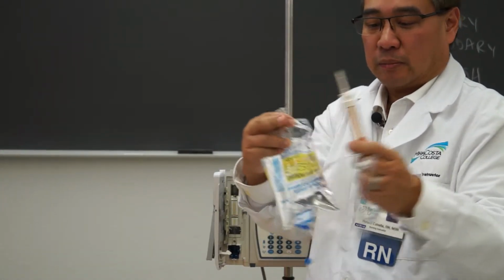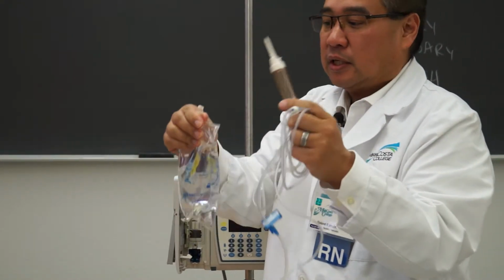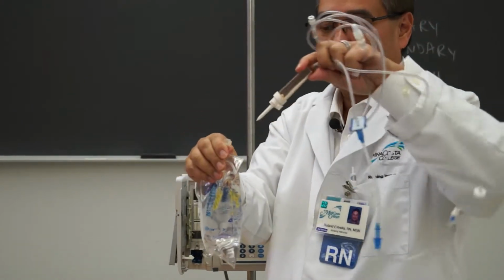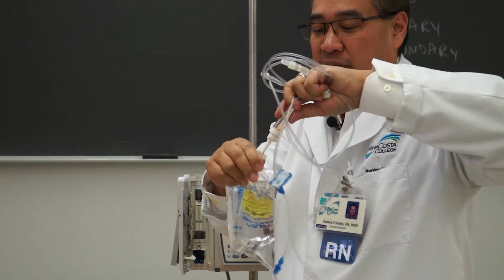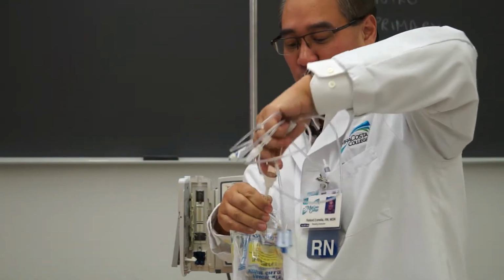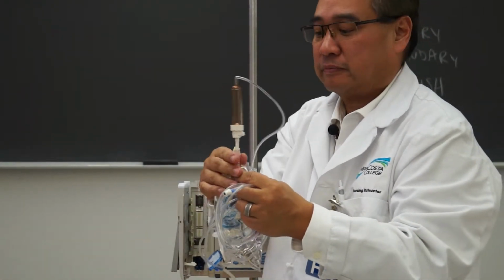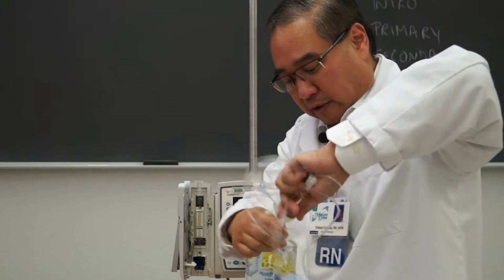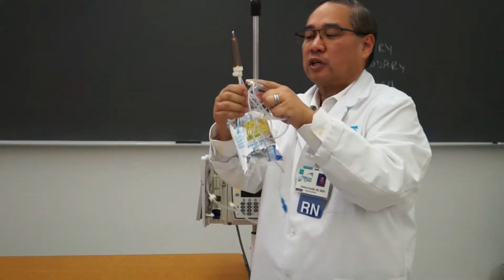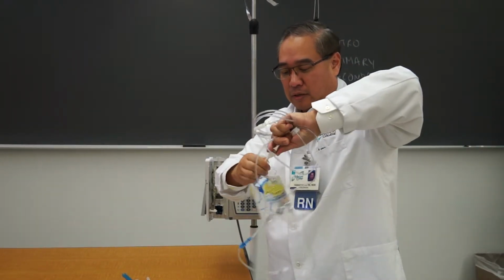Now, when you're ready, you want to control the ends of the tubing. You're going to introduce this spike into the bag without trying to go through the sides. You want to go in straight. And you can imagine that if you didn't go in straight, you went in crooked, it is possible for this to poke through the sides of this bag here and you can potentially harm yourself. Now, how far do I go down here? I'm going to keep twisting in a back and forth motion until I reach the collar here and go down as far as I can.